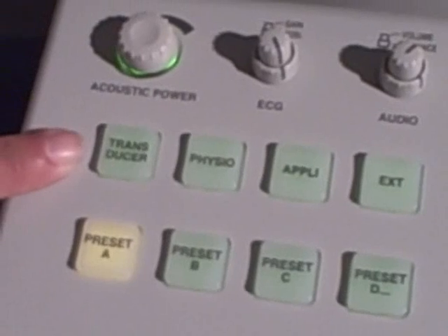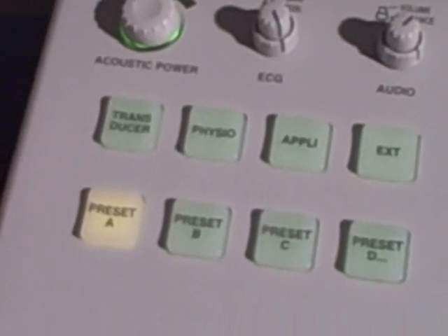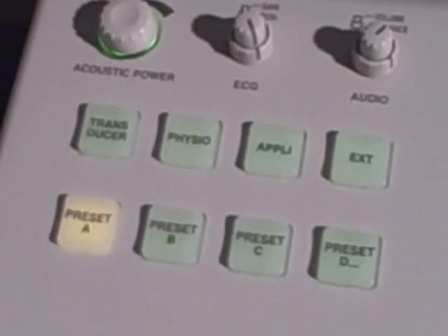With these buttons you can make a protocol. You don't need to know all the buttons of the machine.